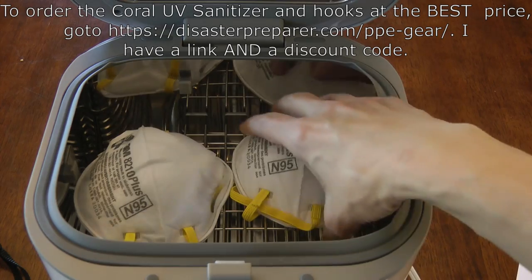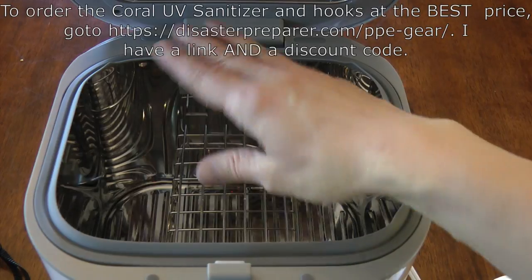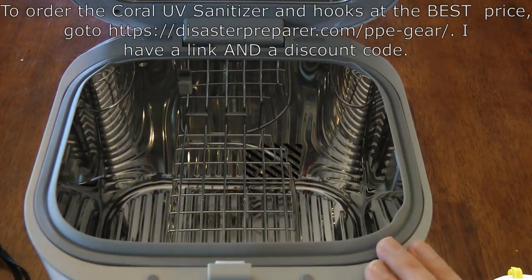Five hooks get mounted. You set the basket in upside down, threading the front hooks and resting it, and then you just set your two respirators in there.